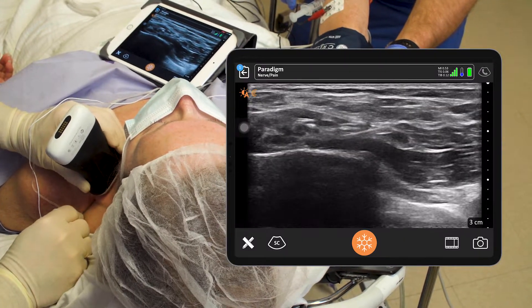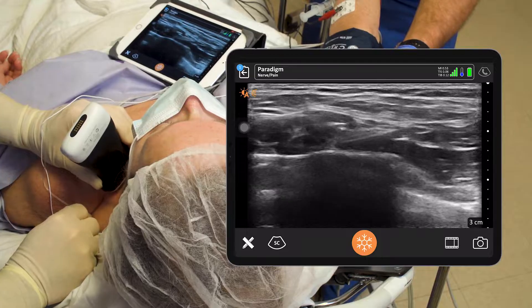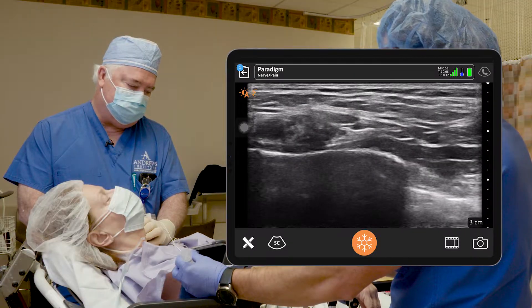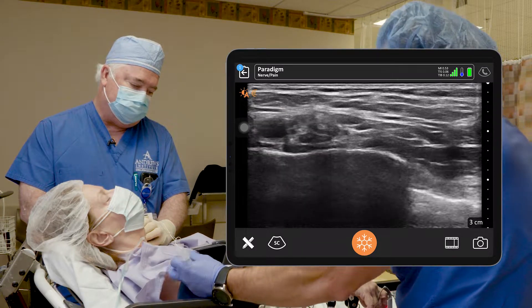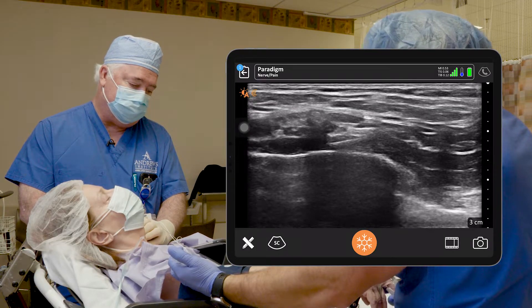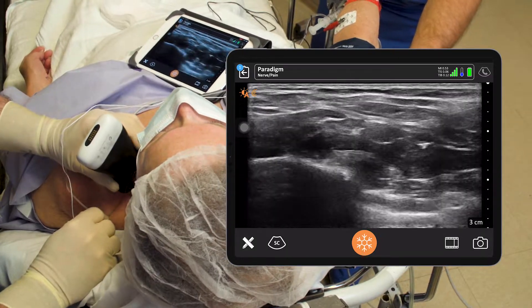I want to get as close to the artery as I can and lift up this plexus. Rocky, give us five CCs right there and see if that'll lift up our nerves — aspiration first. Beautiful, just like that. So that looks really good.